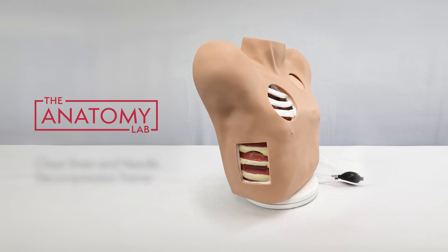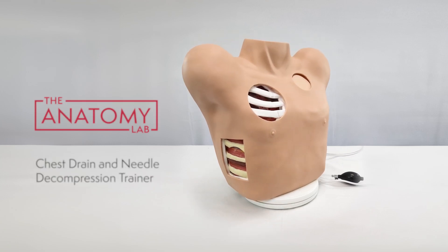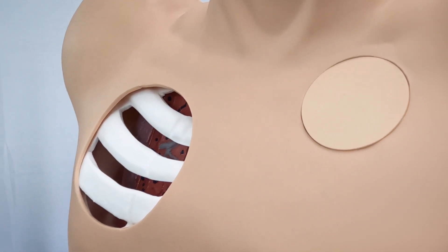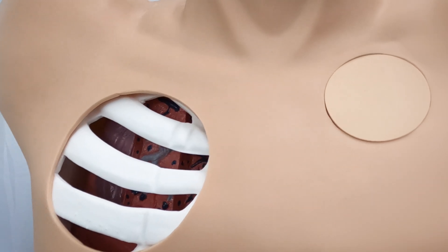This is the Anatomy Lab Chest Drain and Needle Decompression Trainer. It is a model of an adult male torso designed to simulate needle decompression, chest drainage, and chest post-operative care.